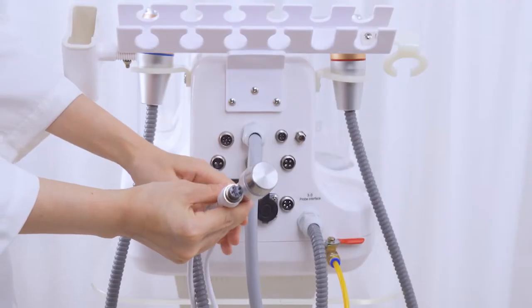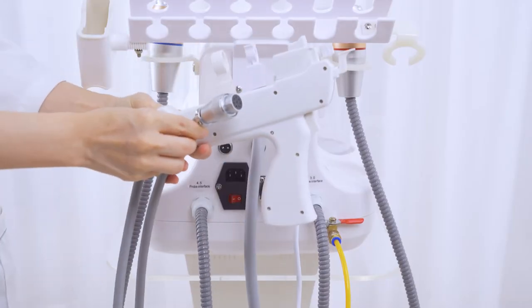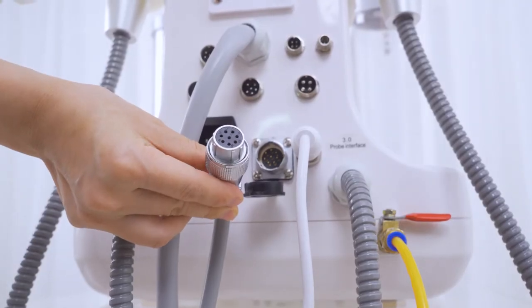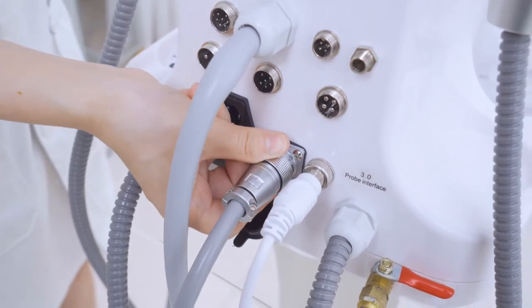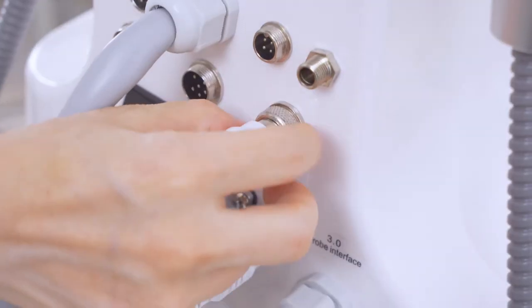Connect the ultrasound handle with the device and tighten the screw. Connect the vanadium titanium handle with the device and tighten the screw. Connect the microelectric handle with the device and tighten the screw.